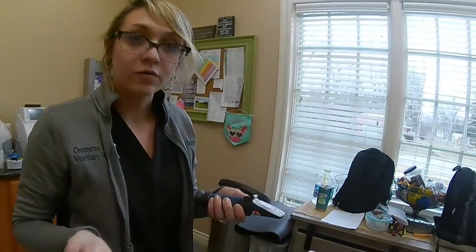Alright, so that's what I would record and give to my veterinarian alongside with all of the leukocyte count that I did, my percentage for my red blood cells, and then kind of any abnormalities that I've seen in any of the cells, and kind of take all of that information and pass that on to my veterinarian for my complete blood count.